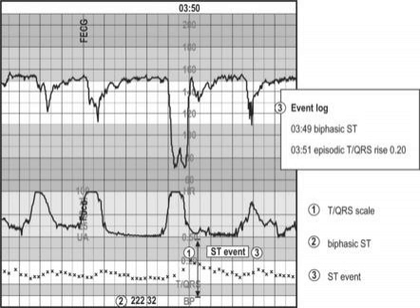By starting with fetal heart rate tracings, have we backed ourselves into a corner? Perhaps we can't do much better than we already do with the NICHD guidelines, and if we really want to reduce interventions, we should look at other causes like labor dystocia. Now, let's keep those thoughts in mind as we move on to the next and last method, ST waveform analysis.